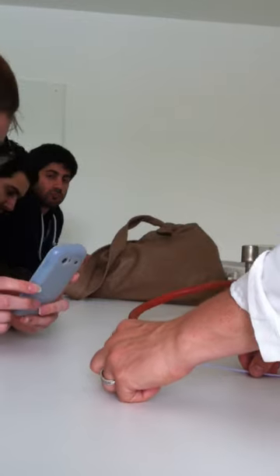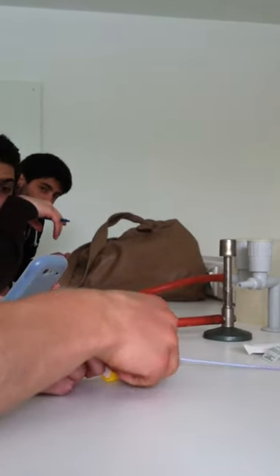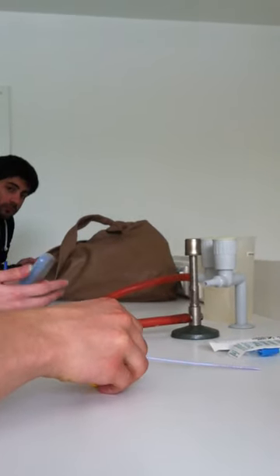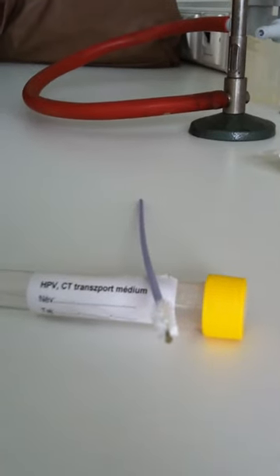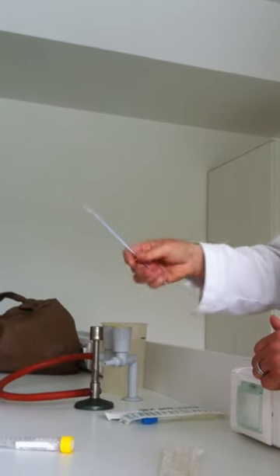Cyto brush. You can see that this is useful for human papillomavirus or chlamydia, both intracellular microorganisms. Chlamydia is a bacterium, and papillomavirus is a virus, but intracellular, so you should collect cells, epithelial cells. And for this, you can use this cyto brush. You should introduce it into the urethra as deep as possible, then turn very strongly, aggressively, and then remove.